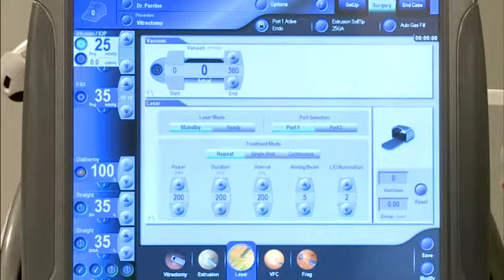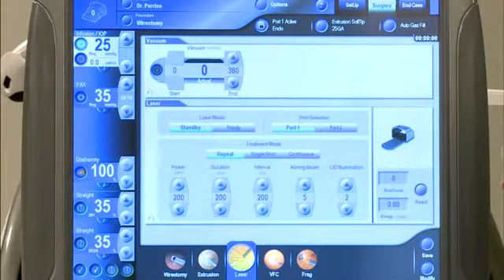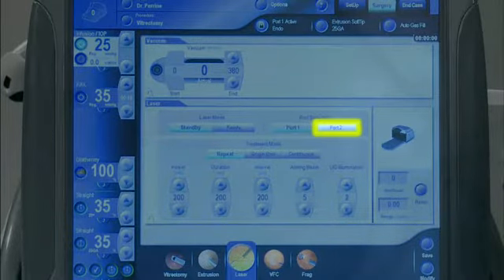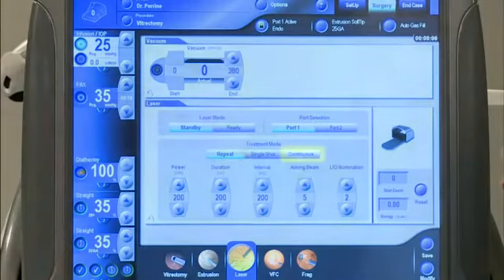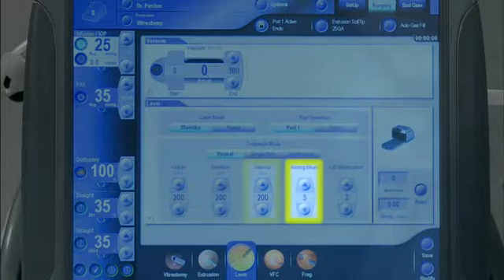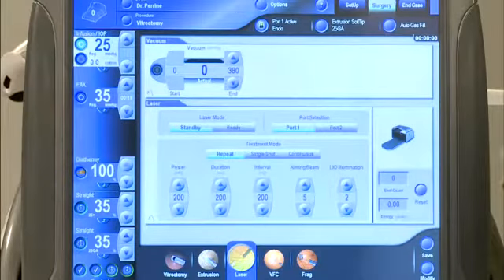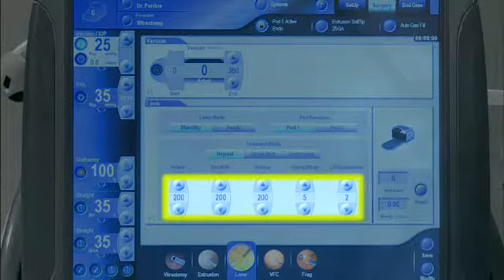Laser parameters will now be displayed on the surgery screen. These are Standby, Ready, Port Selection — Port 1 or Port 2 — Repeat, Single Shot or Continuous, and Power, Duration, Interval, and Aiming Beam and LIO Illumination Intensity. To change any of these parameters, press the associated up or down arrow keys.